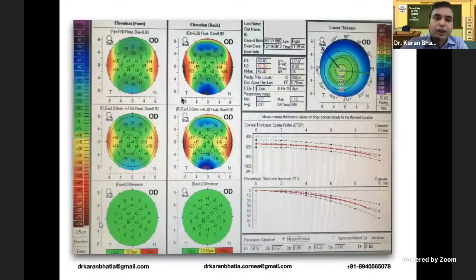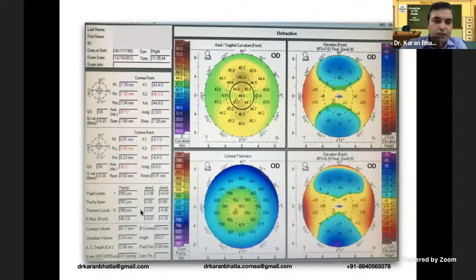In this case, K1 and K2 are fine, Kmax is 46.3, and the thinnest cornea is fine. There is a symmetrical bow tie pattern with every other parameter normal. This is suggestive of with-the-rule astigmatism. If you have against-the-rule astigmatism, the bow tie will be oriented 90 degrees opposite.